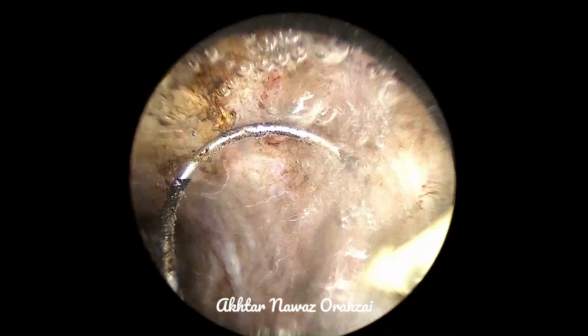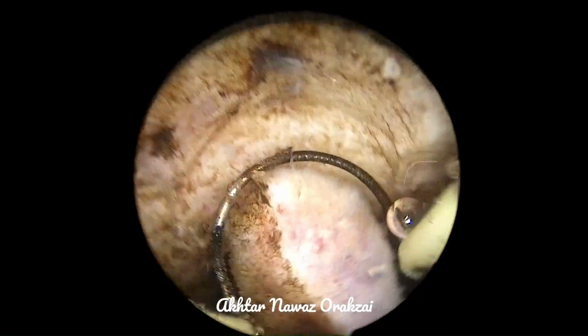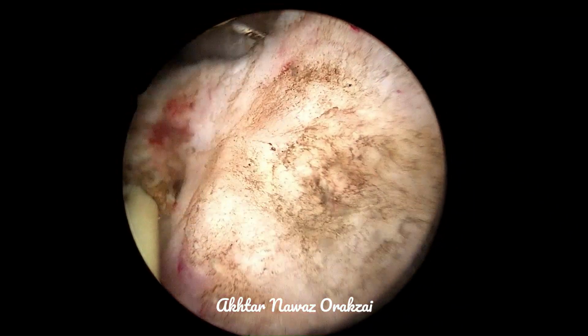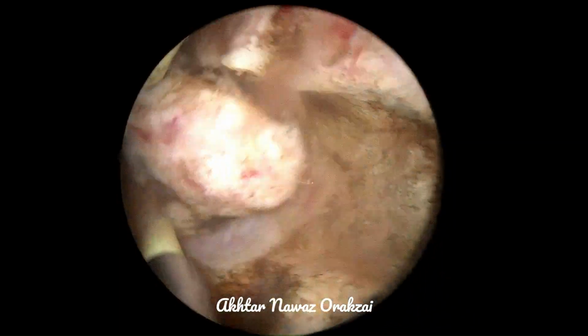And the second sign that we are near to the true capsule is the bigger vessels, brisk vessels and arterial vessels.